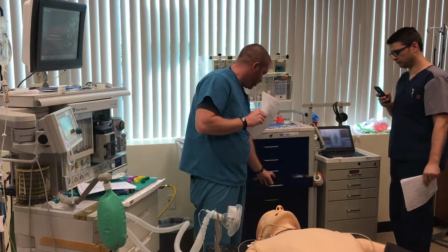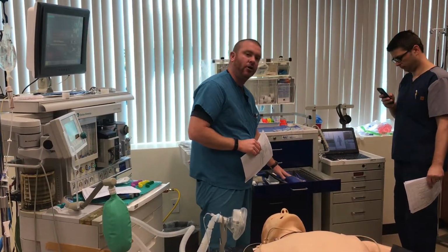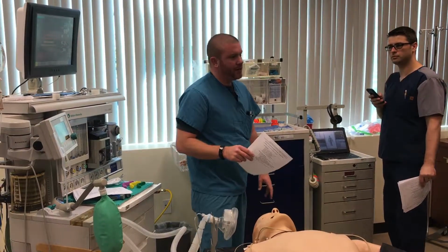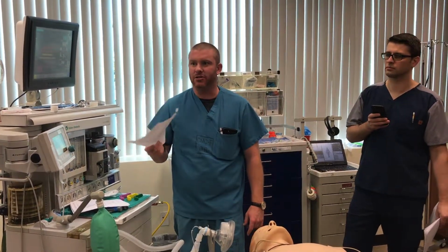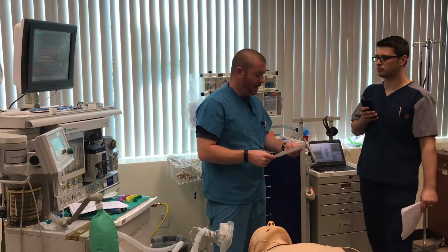Your emergency drugs are placed in a towel that'll last you the whole day in here. Okay, hopefully you don't need it, but if you do, you have it. With that said, I'm going to do a regular induction for you all so that you guys can start to practice this going through the rest of the day, or the rest of the week.